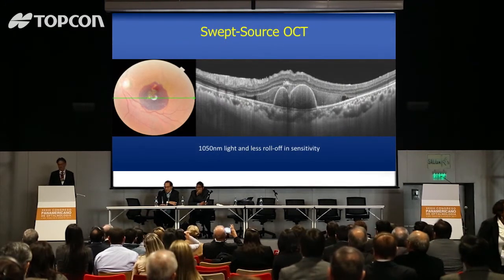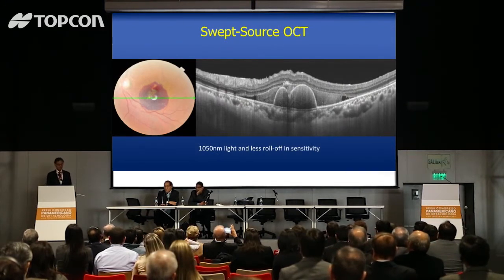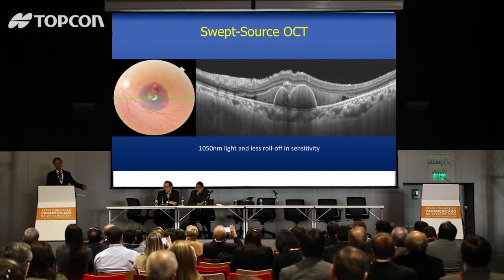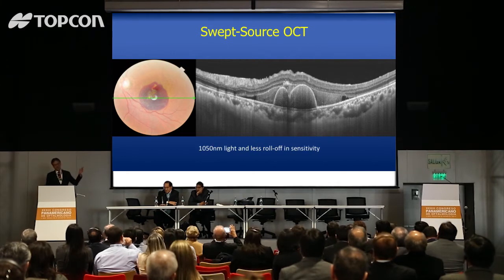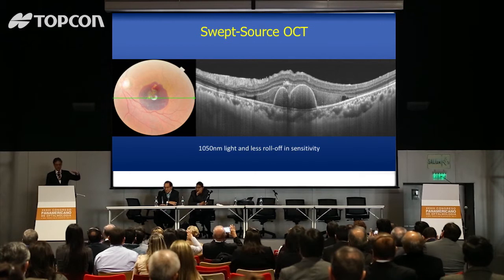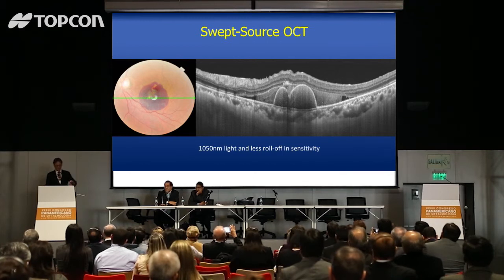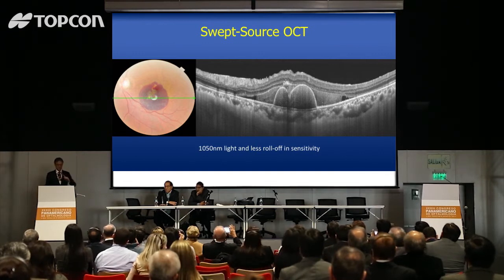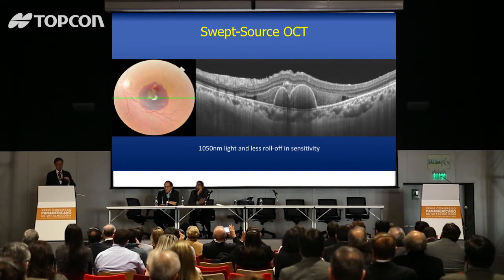Here's another example of the advantage of swept source OCT. Swept source uses a slightly longer wavelength, which has the ability to penetrate particularly through blood. This patient has a sub-retinal hemorrhage associated with polypoidal disease. You can look through the retina, through the blood underneath the retina, through the blood underneath the retinal pigment epithelium, and still see the choroid very nicely. With spectral domain we had a hard time seeing the choroid under ordinary circumstances. Here it's easy.